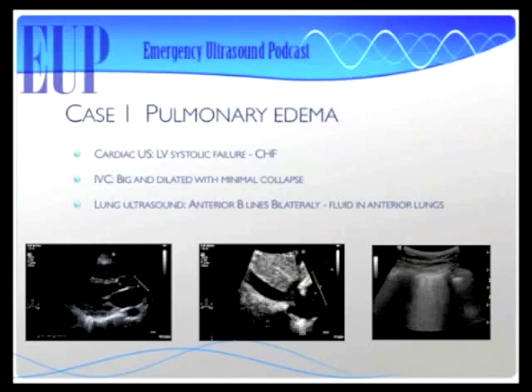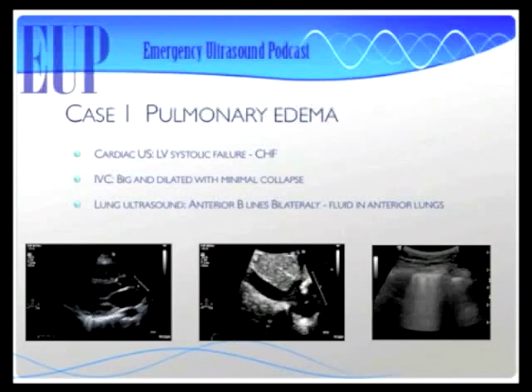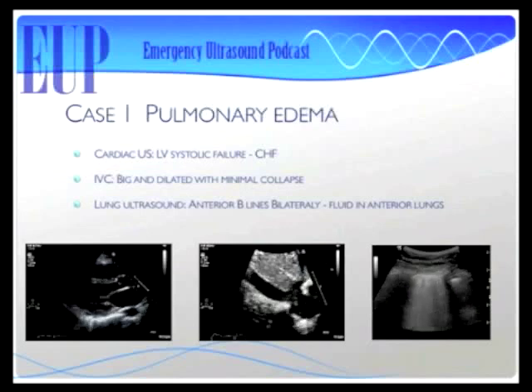And I'm telling you, you can diagnose heart failure on a patient using this particular protocol. I mean, I don't have any data to back this up, but without a BNP and without a chest X-ray, without everything. Well, you said you don't have any data, but there is that. Isn't there that study looking at B lines versus BNP and academic? Yeah, there was that one. That was a pretty good study. Look that up. The B lines.